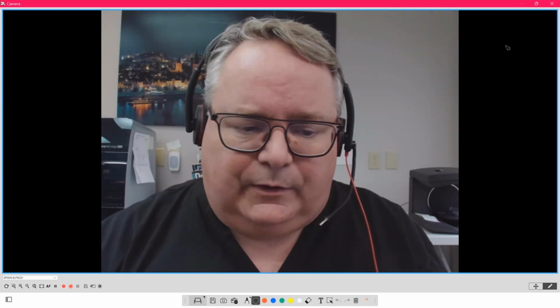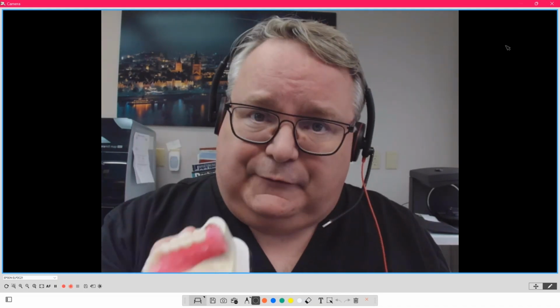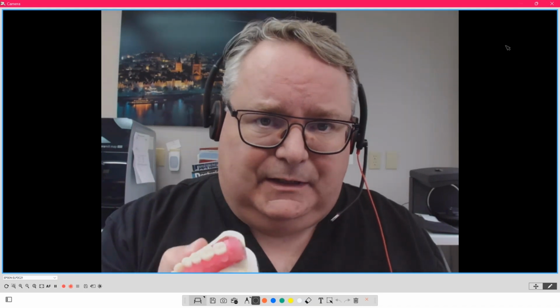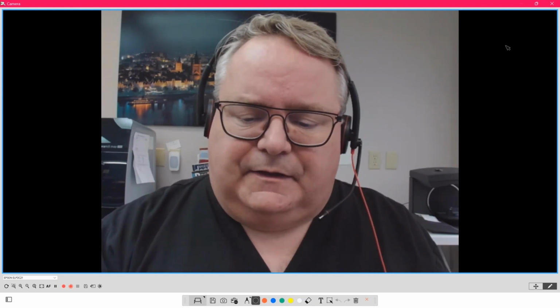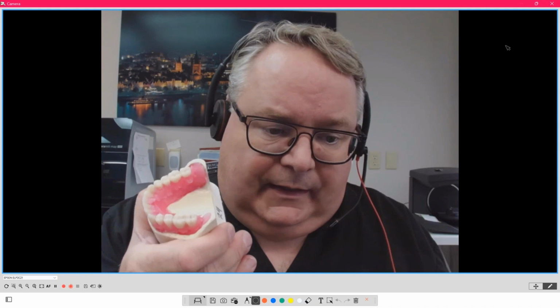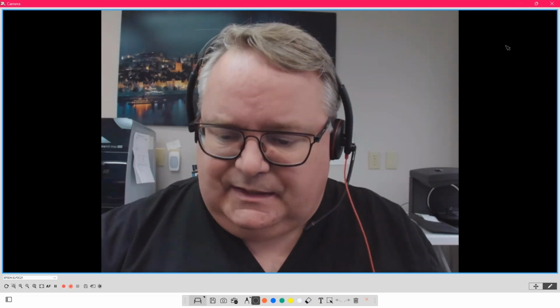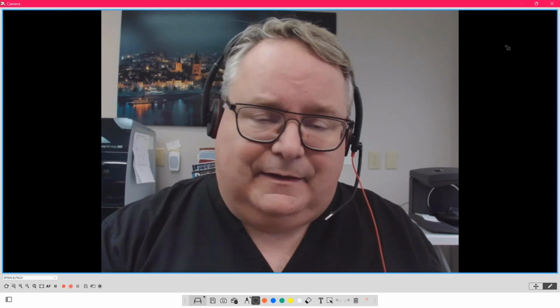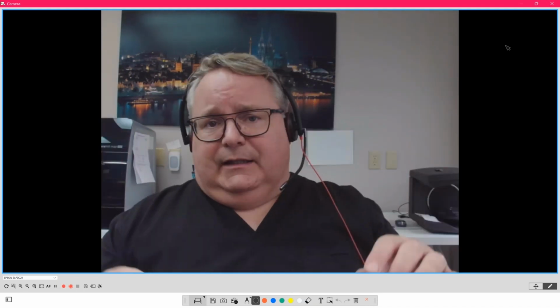So that's the long-winded story to answer question number 1, that this has worked well for me and has reduced my stress and my angst and made me happier in my professional career because I have more stability and control. So whether you deal with the patient directly or indirectly through the dentist, this is a concept that you can set up. It sets up like 20-degree or 30-degree or 33 or 10-degree teeth. You can set them on a flat plane. You can set the upper first or the lower first. It doesn't matter. At the end of the day, what's different about this setup, although it appears somewhat similar to a 20-degree tooth, it does have a little bit more spacing and gapping in it.